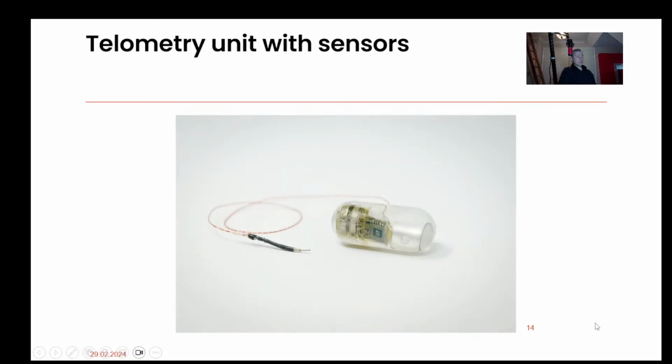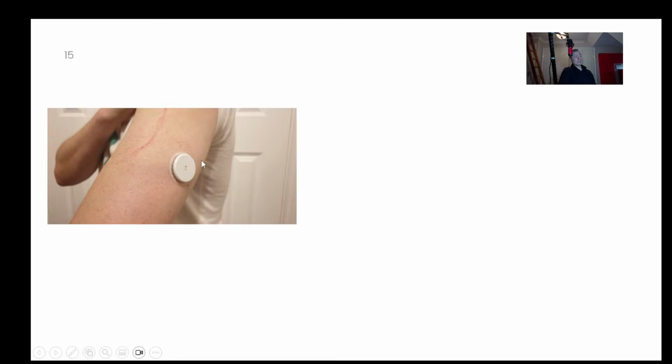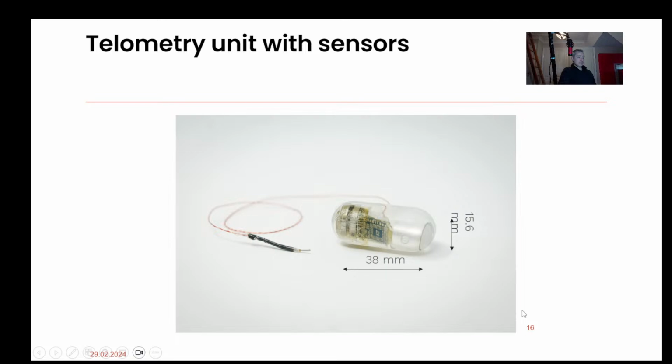This is an example. This is a system that we have that looks like one of those transdermal CGMs that I was trying to highlight on the other page. The wires bring the signal in. This is the electronics here, and this device has power here and a transducer here. It's not Abbott's Freestyle Libre 2, but the technology in here is pretty similar to the technology in there.